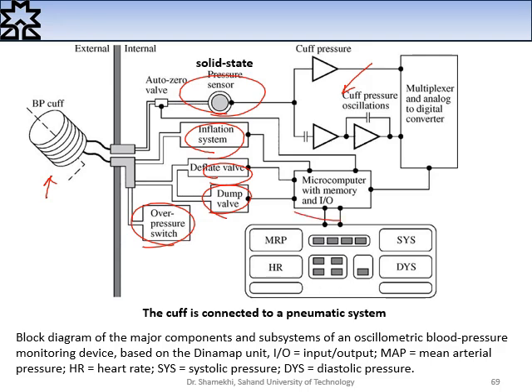Also, we need a microcomputer to control, analyze, and process signals, and also we need a display to show the parameters and to better monitor the system performance.